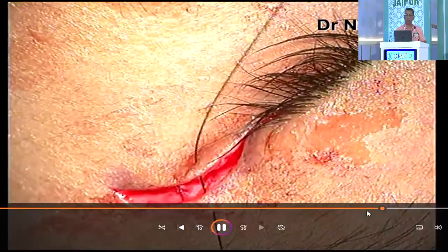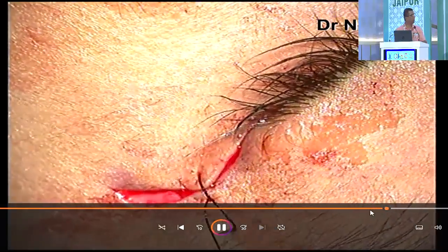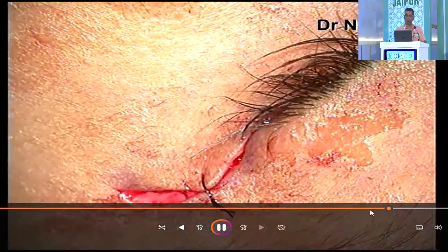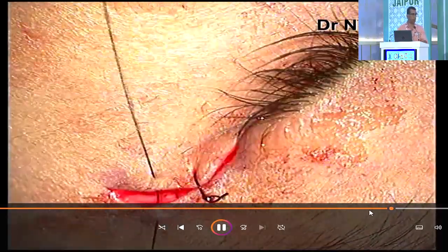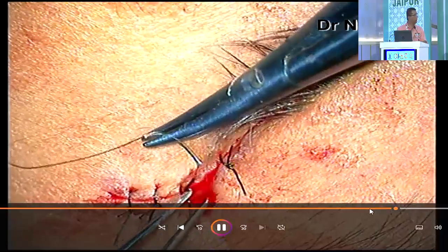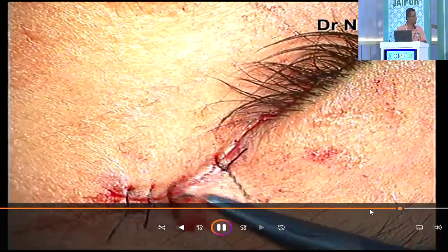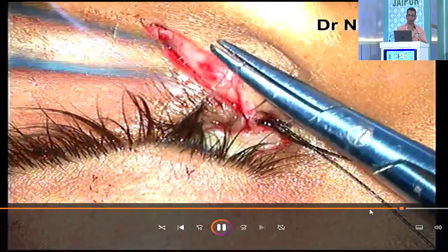That will help in healing without any problem. Cut through sutures are quite common. The skin in a child of 1.5 years is slightly elastic. Even if you can achieve the closure on the table, it should be without traction.